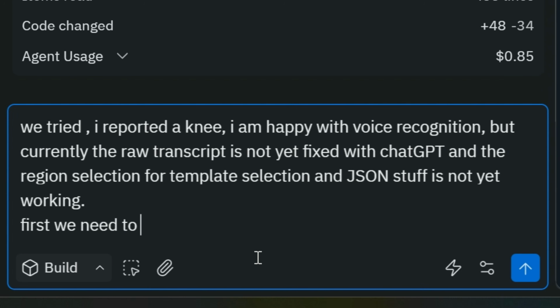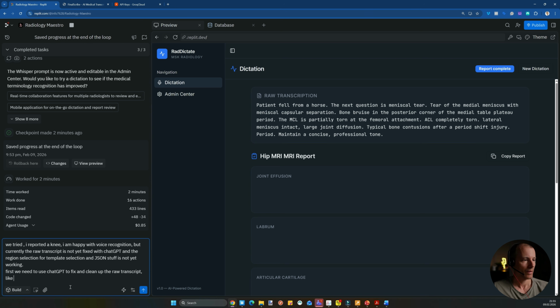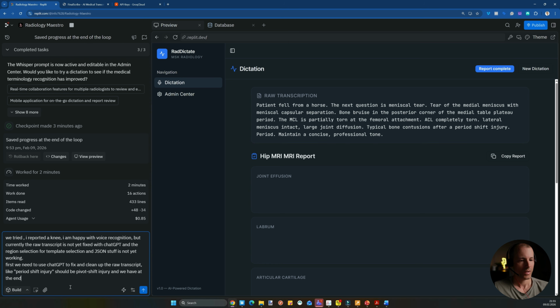First, we need to use ChatGPT to fix and clean up the raw transcript, like period shift injury. Injury should be pivot shift injury. And we have at the end stuff I didn't say.